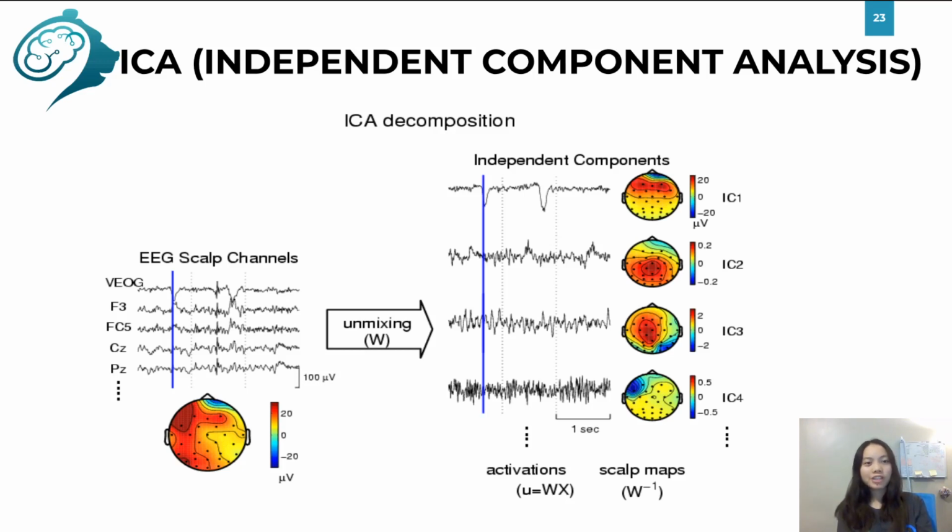For source separation, ICA is generally considered the best since it does not assume orthogonal or Gaussian behavior of the individual signals, which are unreasonable assumptions that other techniques depend on. In any case, ICA still assumes that signals are static and that separate signals are statistically independent, which may not be appropriate for some neural signals.